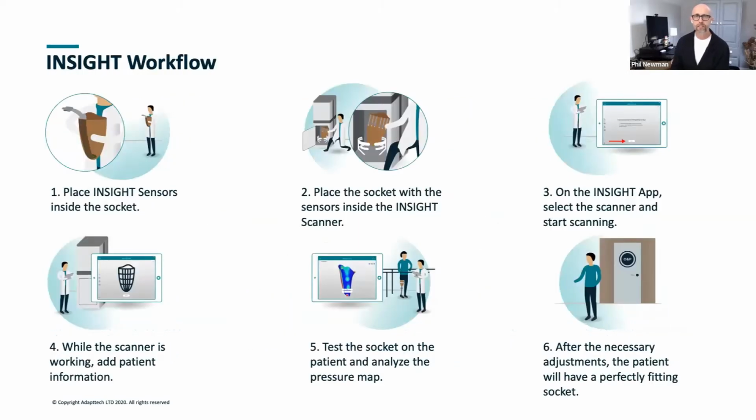So everything about INSIGHT is really about efficiency and bringing as far forward and as fast as it can be the workflow process. So I already mentioned the sockets and the sensors that go inside it. The socket and the sensors go in the scanner. Fred's going to show you that in great detail today. How the app works in terms of assisting with both the scanning process, but also how you profile the patient data that sits within that. And then obviously how the socket works once it's on the patient, and the real insights that are given to the patient and the prosthetist as part of that process.